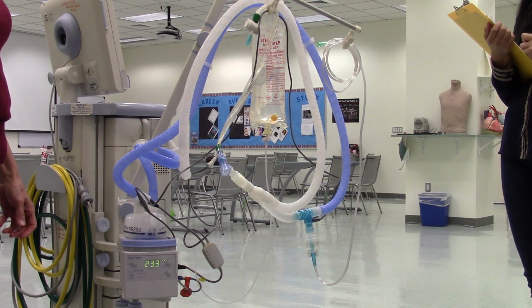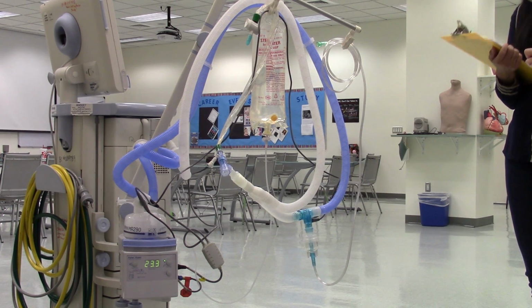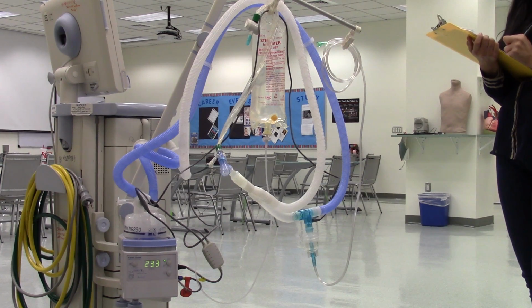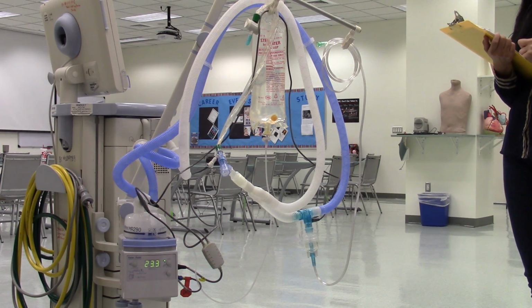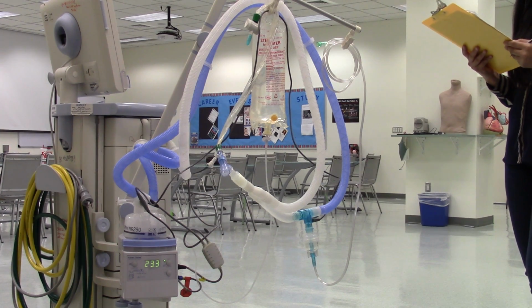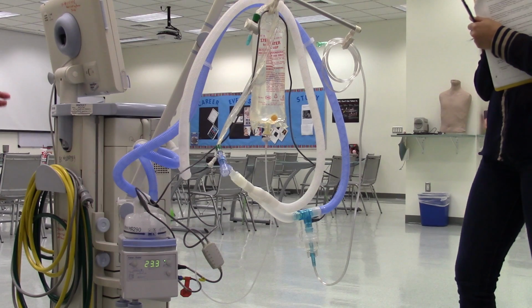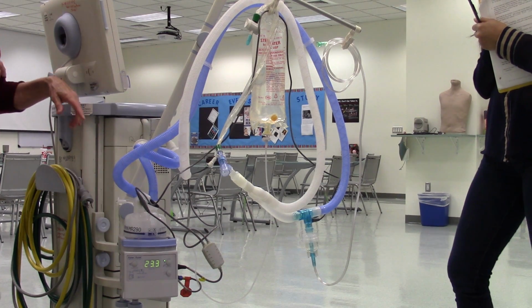It says check your connections, check if there's enough water, check if the temperature is in range. Correct. It says you have completed this assignment, take apart the circuit and all the devices, place each item neatly on the lab countertop. All right, so I can take it apart and then each one of you can put it together.